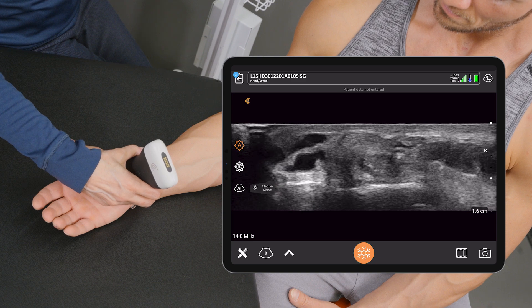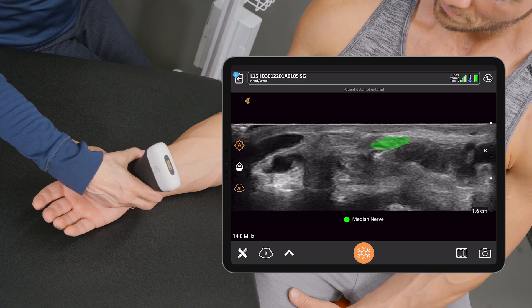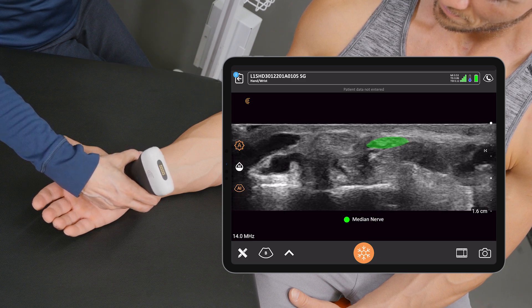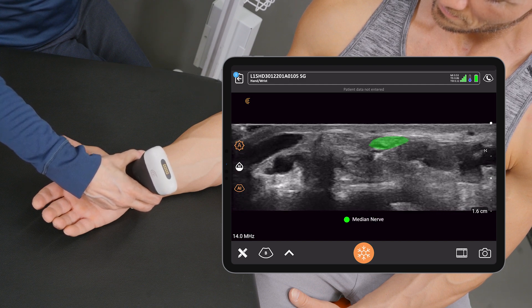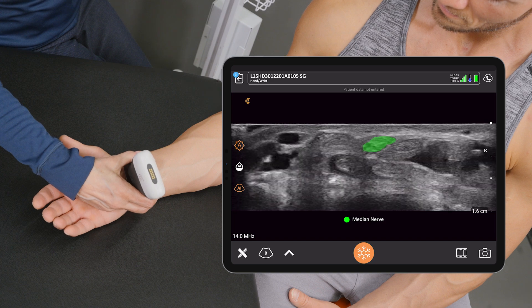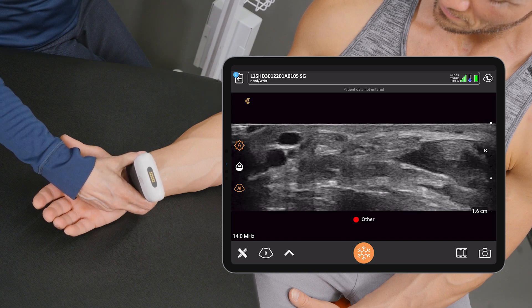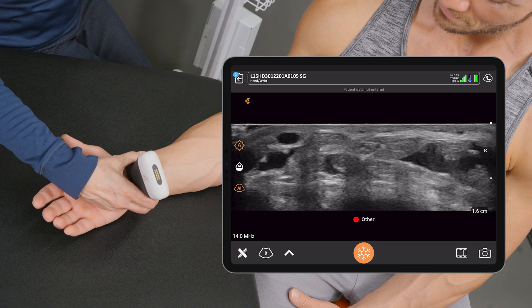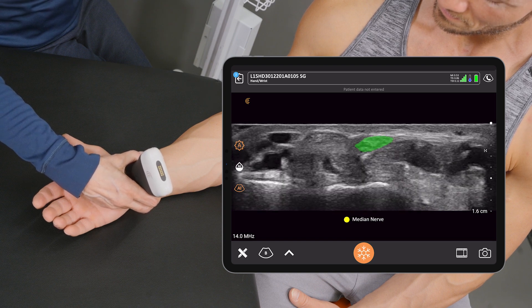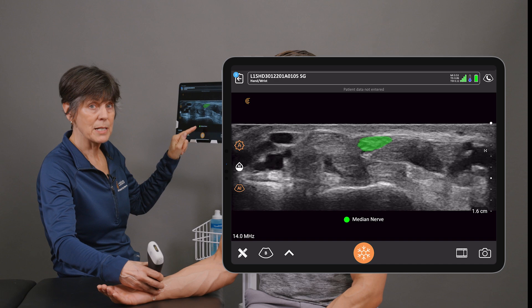I'm going to activate the Median Nerve AI and right away we'll see segmentation of the nerve. I can scan until I'm in the right area, and you'll see there's a quality indicator — if I don't see the nerve clearly enough for an accurate measurement it's going to say 'other,' but when I have a good image it's going to say 'median nerve.'